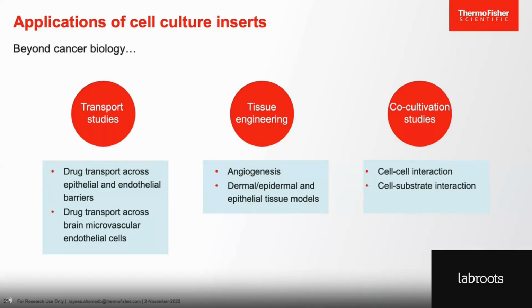And then it can also be used for tissue engineering, like angiogenesis. We can use them to model different epidermal and epithelial tissue models, which help in skin tissue modeling. And then we can do other regular co-cultivation studies to study any two different types of cell-to-cell interaction. And we can also study cell-substrate interaction with these cell culture inserts.